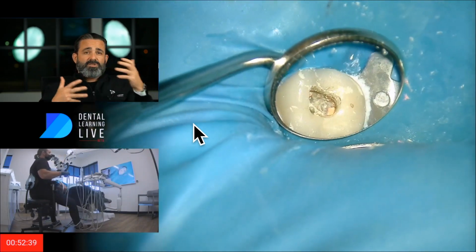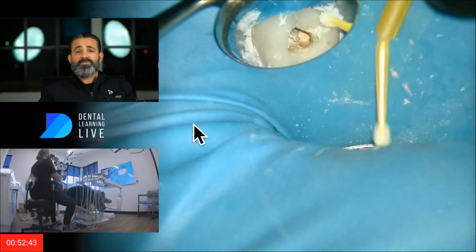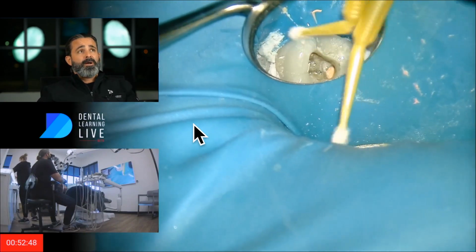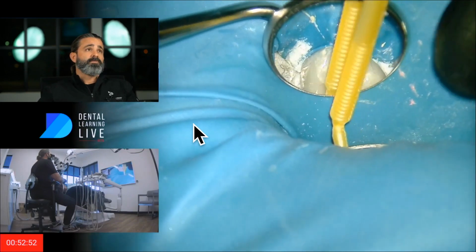And so you just, as you do more and more and more, you start teaching yourself these little tricks. And I would love to hear your tricks, actually. Why don't you guys share with me some of the things you do? And does size matter to you in obturation?